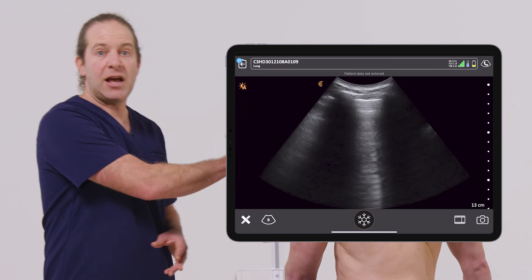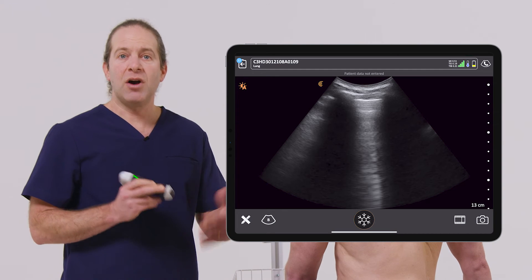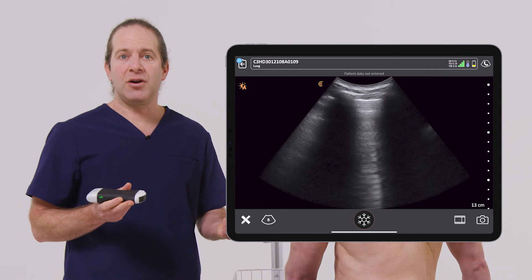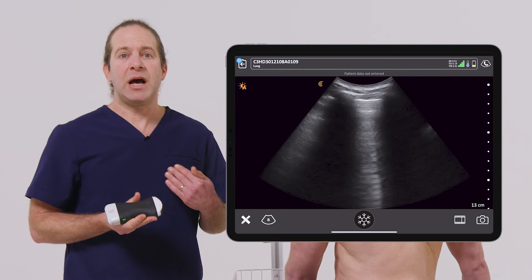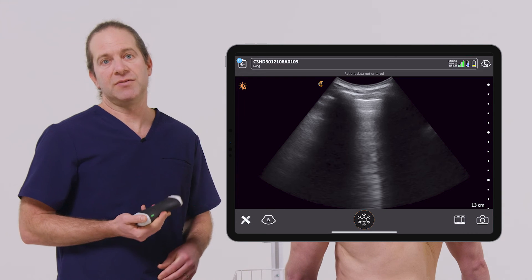I'll repeat the scan on the other side of the chest, and using all that information together, put it together to help facilitate my diagnosis and management of this patient.